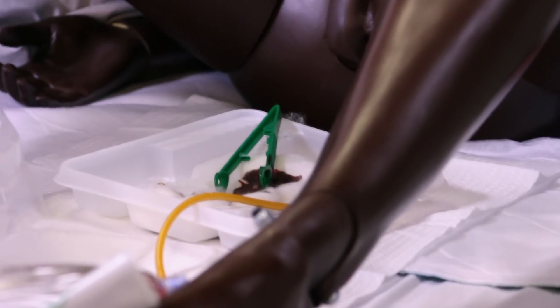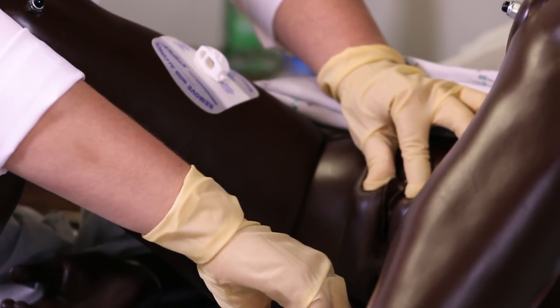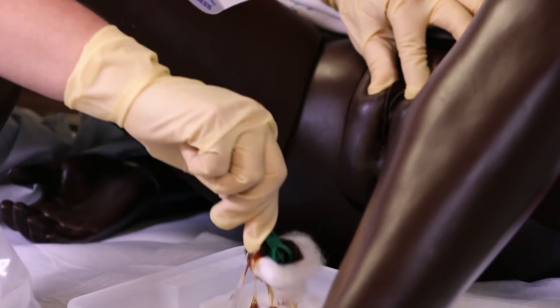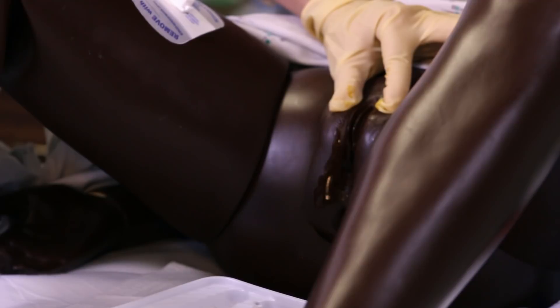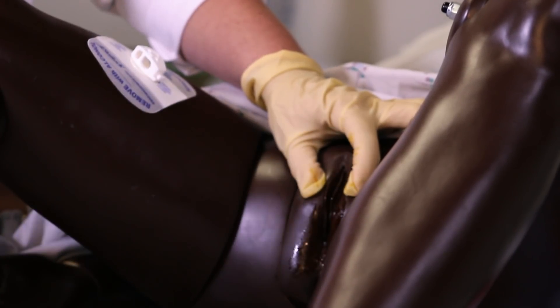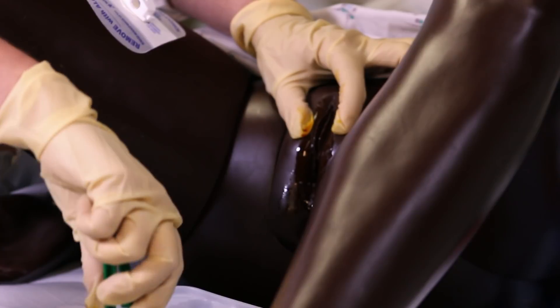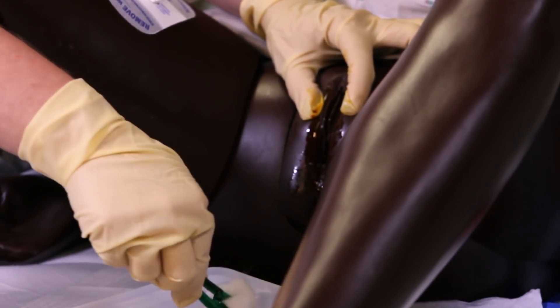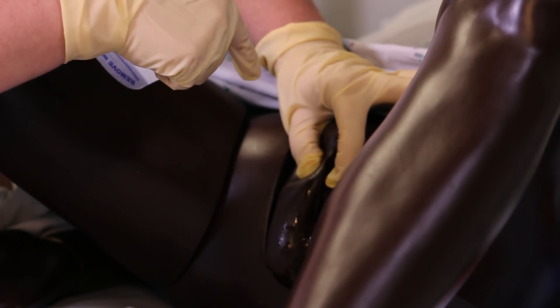Now with my non-dominant hand — keeping in mind this hand is no longer going to be sterile, it's just clean — I separate the labia. Take one cotton ball and take a swipe down the far side of the labia, throw it in the garbage. Another cotton ball on the side closest to you, again in the garbage. Then a final one to go straight down the center. At this point we've cleaned our patient. Spreading the labia, you can see the top hole is the urinary meatus, the second hole is the vagina, and the bottom is the anus. You want to insert the catheter into the urinary meatus.